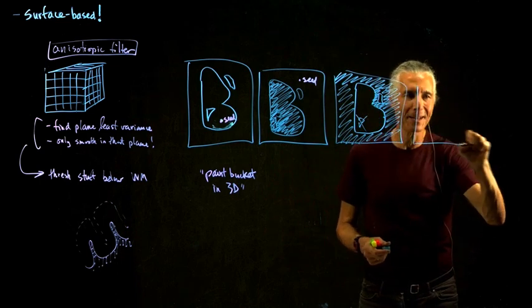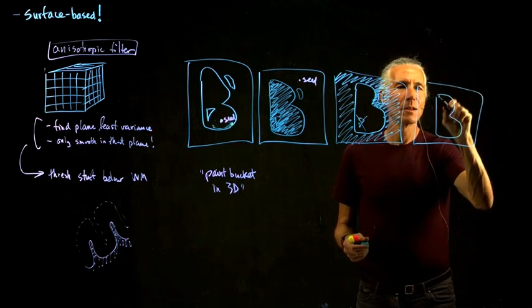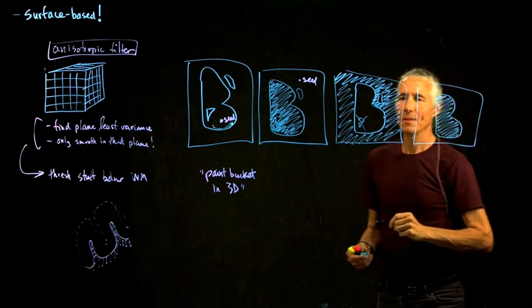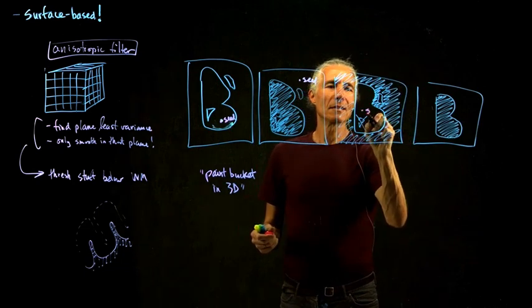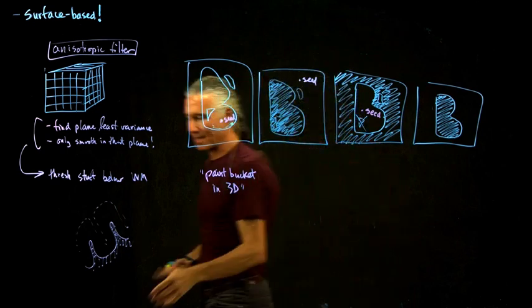So we do it again. If we do it again, then we just end up with just a filled up. So we start another seed, and do this again. And so now what we have is just a solid block of voxels.